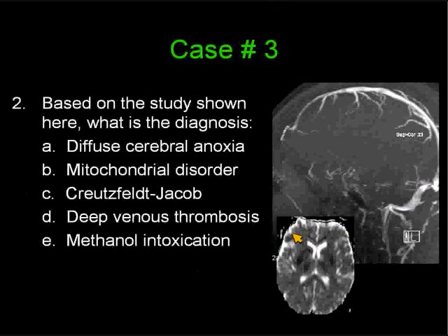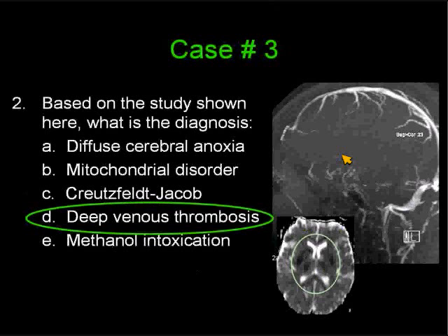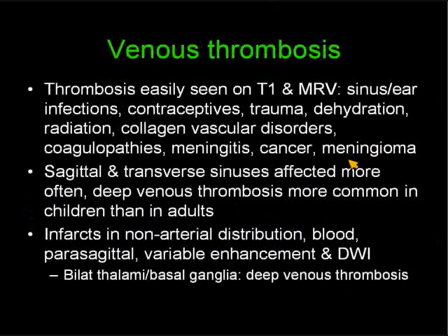Let's take a look at the answer. The majority of you said deep venous thrombosis, and it's pretty obvious from the MR venogram that the deep venous system is missing. You don't see the thalamostriate veins, the internal cerebral veins, the vein of Galen, the straight sinus, or the basal vein of Rosenthal. Those structures are the ones that drain the central aspect of the brain, illustrated on this ADC map, which shows restricted diffusion involving the basal ganglia and also the lateral aspect of the thalami. Venous thrombosis is well seen on T1-weighted images and on MR venograms.